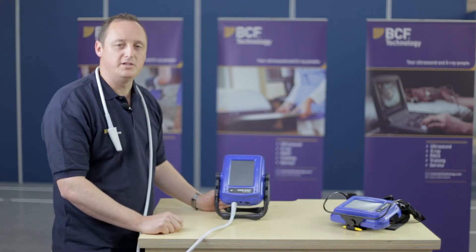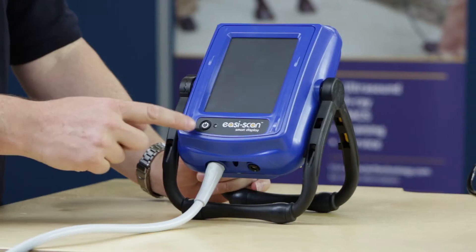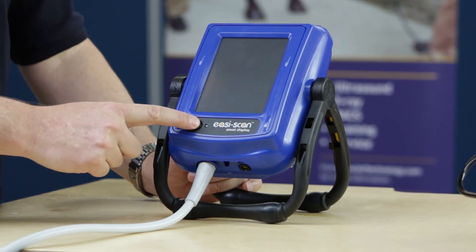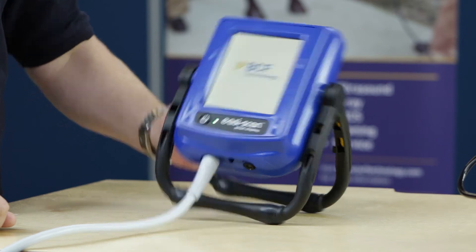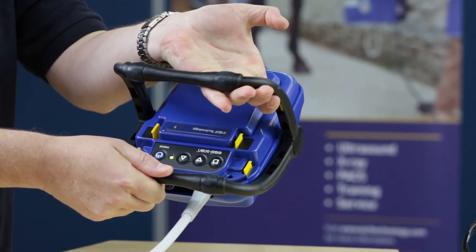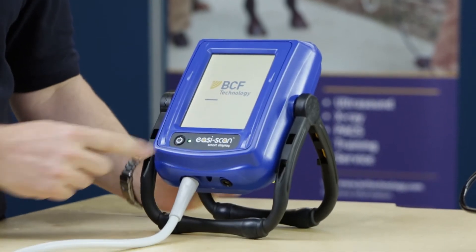Now we have the EasyScan and the smart display connected. We now need to turn the system on, simply by pressing the on button and holding it down until you hear a double beep. There's no need to turn it on from the bottom because we have one on button at the top of the display.